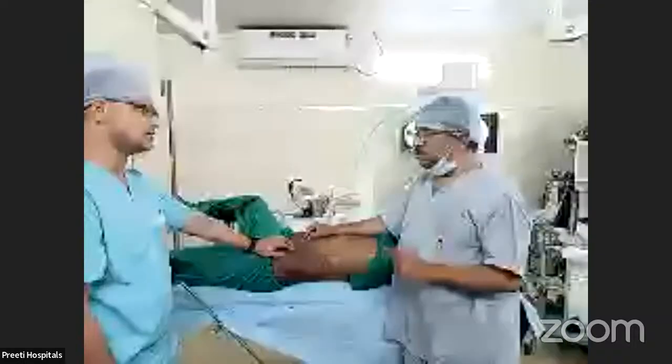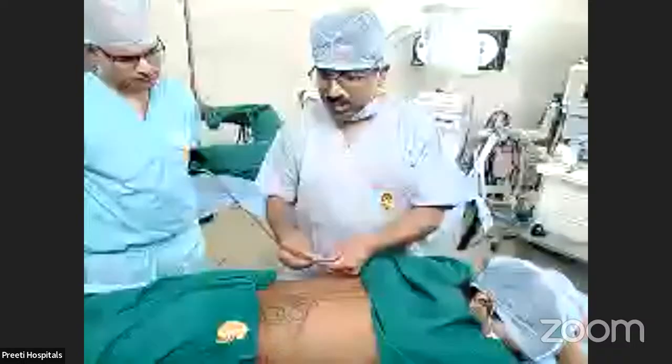So now coming to the case with a stone in the pelvis, a stone in the inferior calyx, and a stone in this one. Now what will you prefer? Large stones, I will prefer prone PCNL. I will come from the superior calyx. Through the superior calyx you take out the pelvic stone.